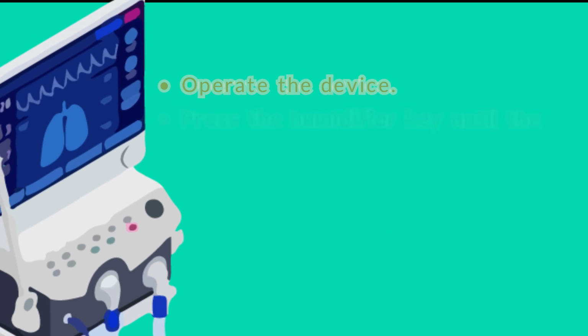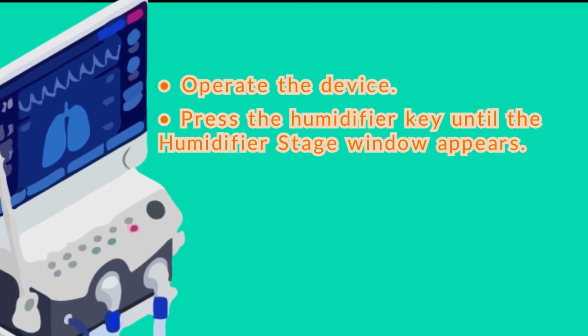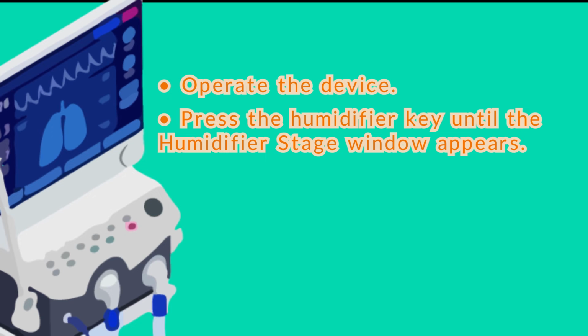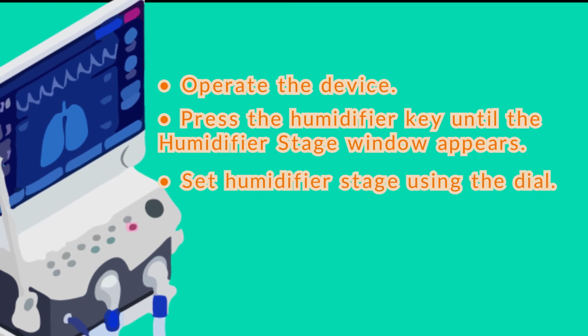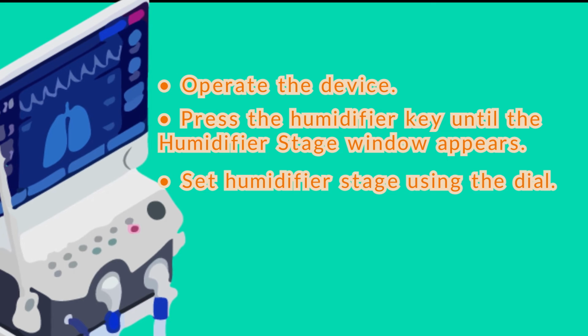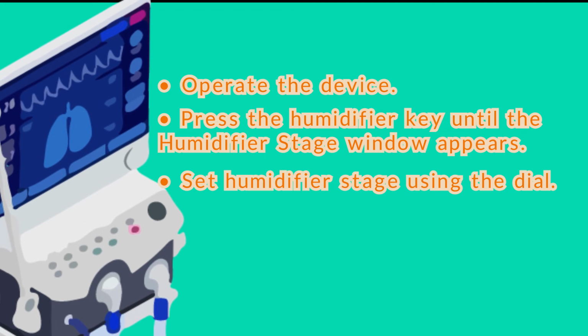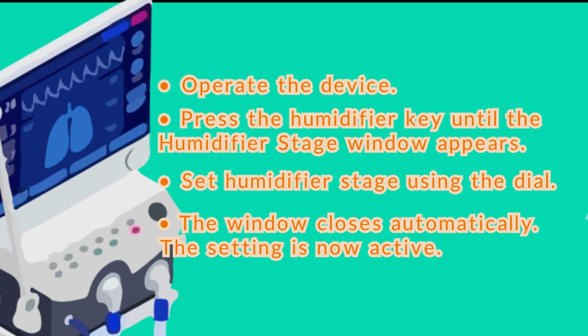Operate the device. Press the humidifier key until the humidifier stage window appears. If you press the humidifier key without a respiratory air humidifier being attached, the device does not switch on this function. Set humidifier stage using the dial. Alternatively, press the humidifier key until the desired heating stage is reached. Confirm your entry by pressing the dial or the menu key. The window closes automatically. The setting is now active.